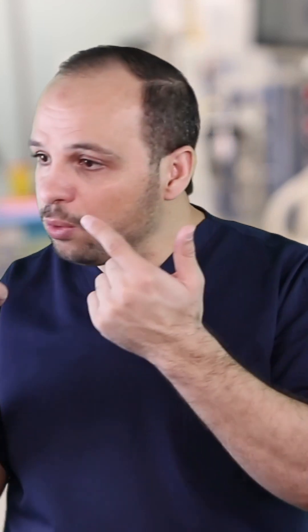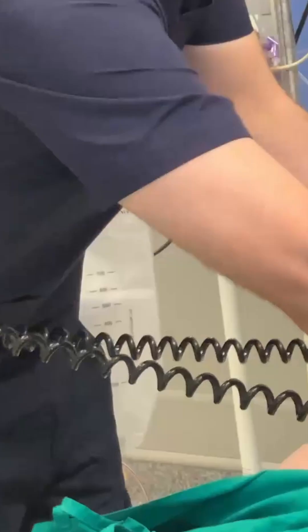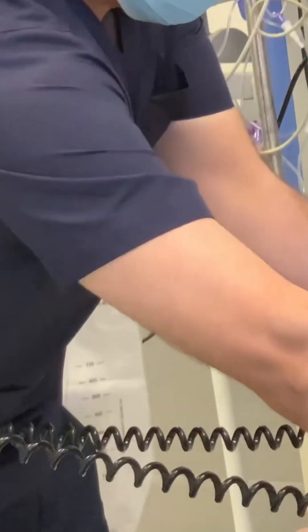Here is the important point. If I'm going to give the shock, I really need to make sure that no one is touching the patient, no one is trying to insert a cannula for the patient, no one is using the ambu bag for the patient. I need to visually confirm there is no one touching the patient. Besides that, I will say 'clear' — a statement that makes everyone aware that a shock will be delivered now.